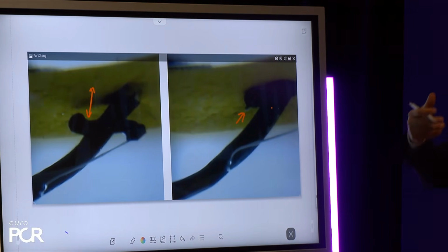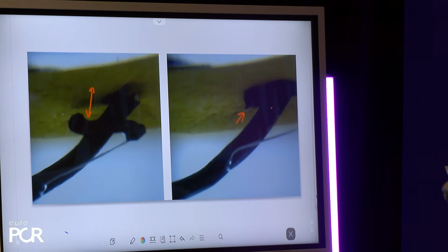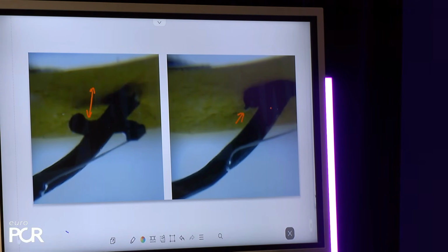That is the needle going through the wall and being anchored on the foot. So there is typically tactile feedback when you feel the anchor against the wall, but there's also the bleed back. If you pull back on your ProStyle and you think you're with the anchor at the top of the vessel wall, but you still see a pulsatile bleed back from the side, you're 100% sure: not good.